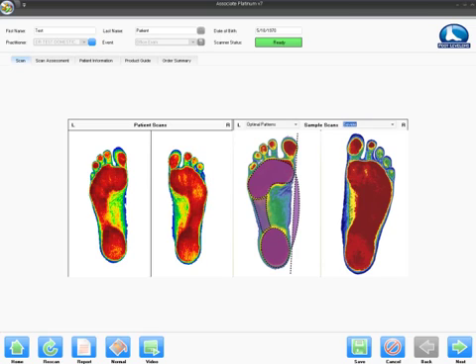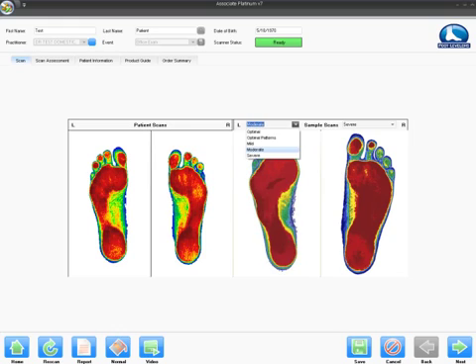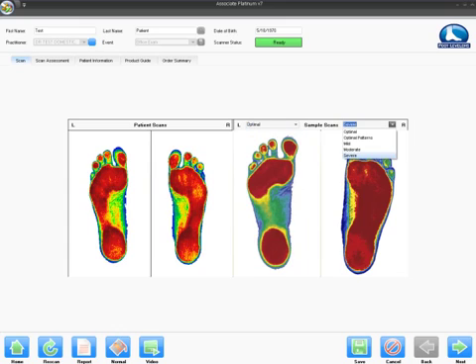From here we can talk about compromised arches. One arch compromise indicates mild foot dysfunction, whereas two arches compromise indicates moderate foot dysfunction, and ultimately all three arches compromise indicate severe foot dysfunction. Remember that foot dysfunction contributes to postural distortion.